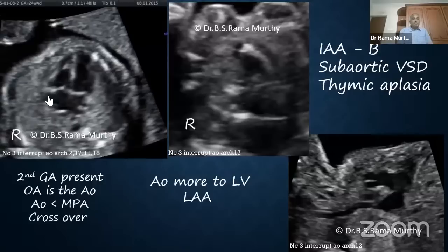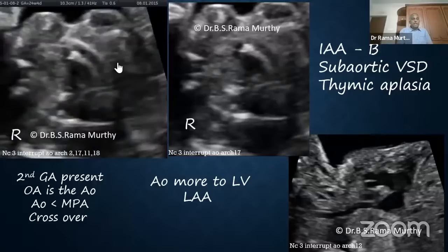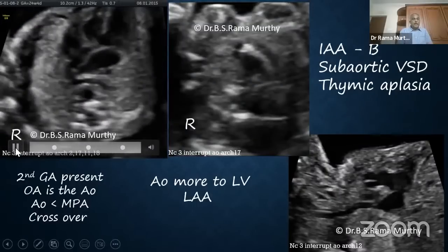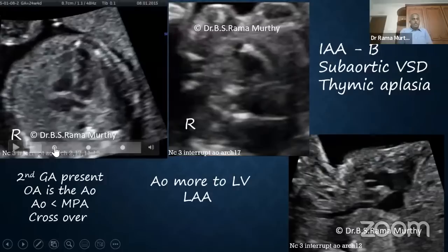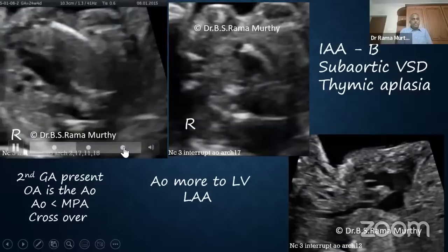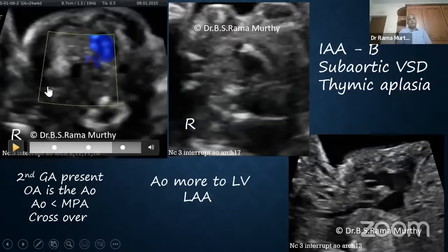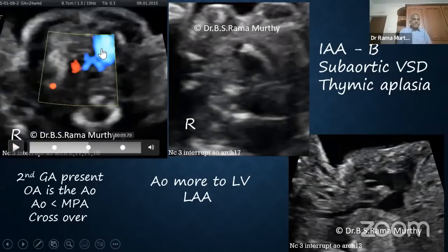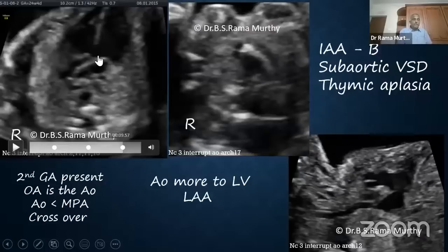You will see that in the four-chamber view, there's nothing much to talk about, but when you come to the left ventricular outflow tract, I will take you to the left ventricular outflow tract. That's the four-chamber view, which looks normal. This is the color of the three vessel. This is the LVOT. You will find that there's a malaligned VSD. There's an overriding of the vessel that you can see here, but this is a narrow vessel.